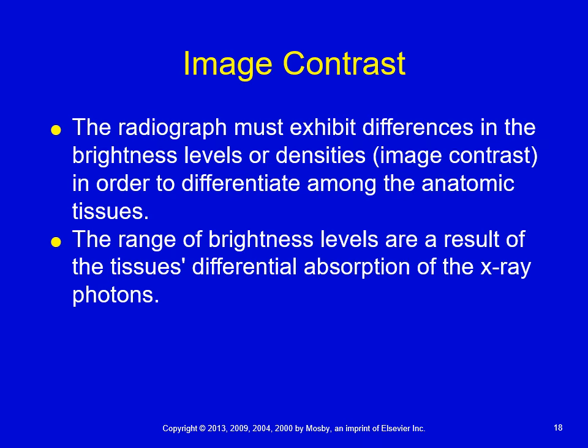The different shades happen, and we spoke about this a little bit earlier, because tissues will absorb the X-ray beam differently, that differential absorption. For example, just going back to what we talked about earlier, bone absorbs more X-rays, while air-filled organs, or air, is going to allow more of those X-rays to pass through, and that's why we see the different shades on the image.